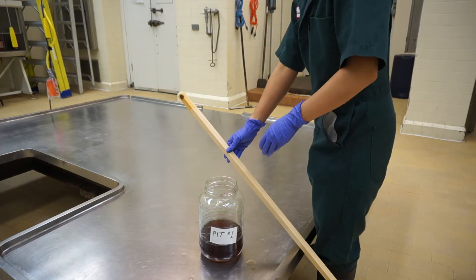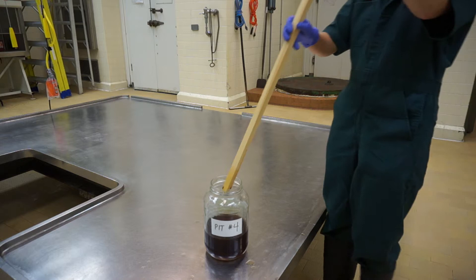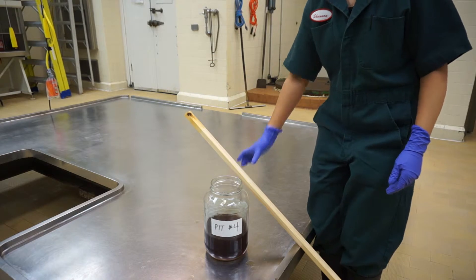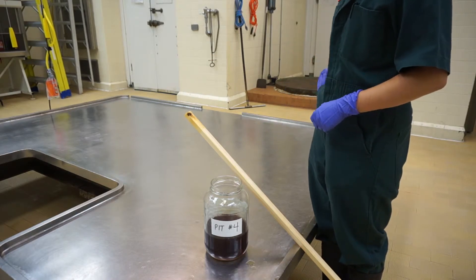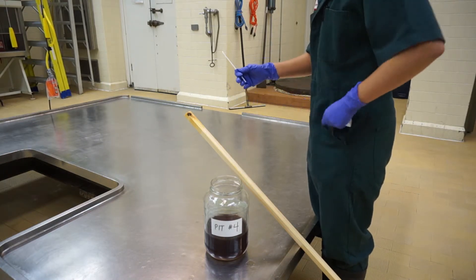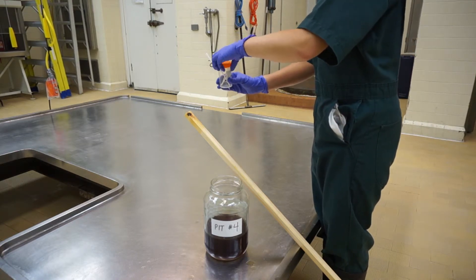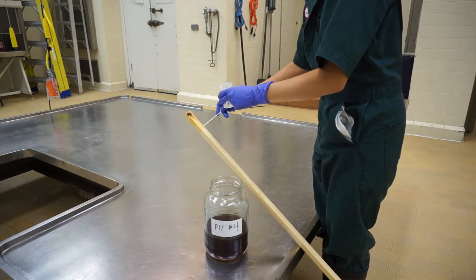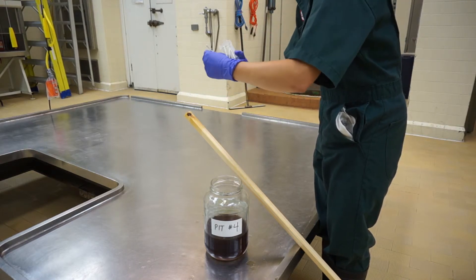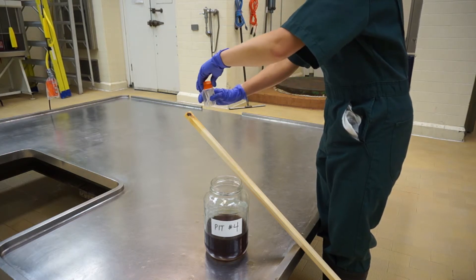Proceed to the next pit and repeat the process. Dip the stick or gate rod into the manure pit. Take out a swab and open the orange top container. Swab some manure off the stick, break the swab stem, and place the manure coated end of the swab in the container. Then reseal the container with the orange lid and put the container back in your pocket.